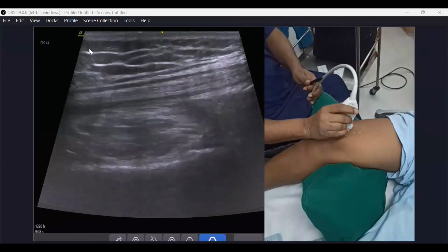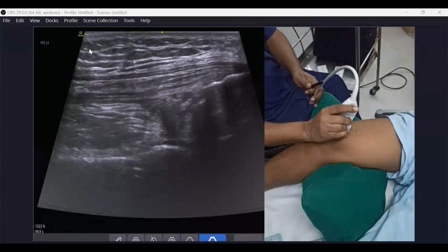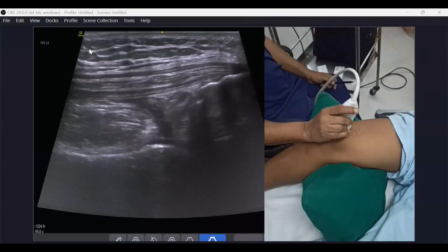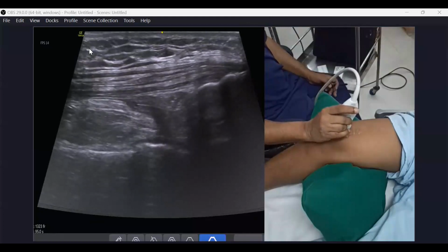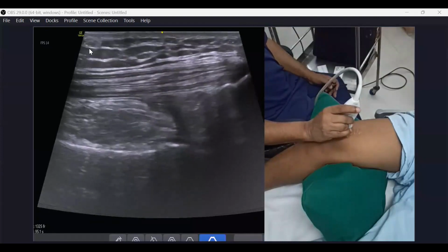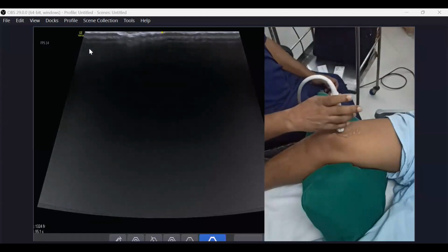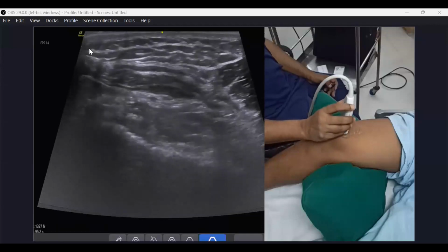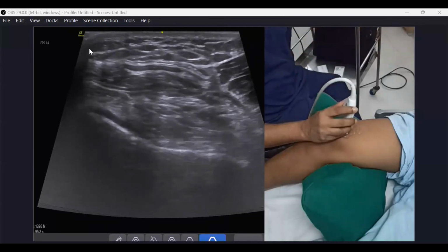If I'm putting our probe here, starting from the patella, let's try to understand all the structures one by one. From above, after the quadriceps tendon, just proximal to the patella is your suprapatellar fat pad, then your recess, then the prefemoral fat pad and articularis genus. Now, if I am holding the probe in the transverse, and our aspect marker is on the left side of the screen, let me freeze it here.